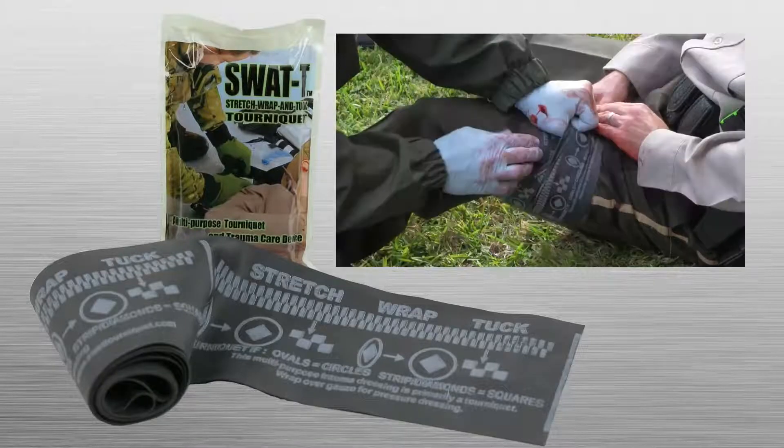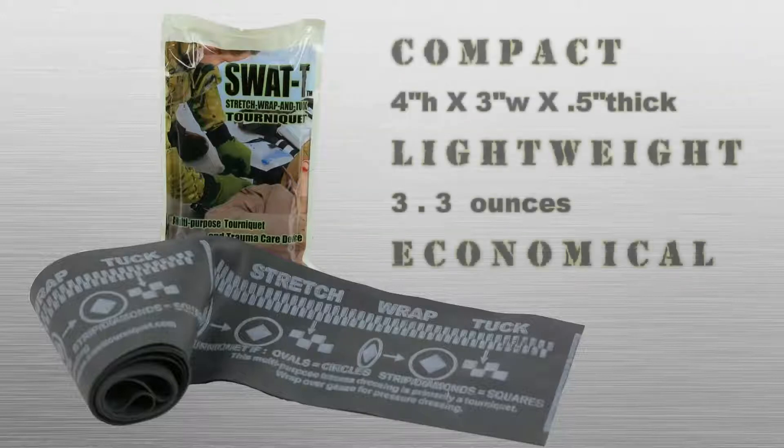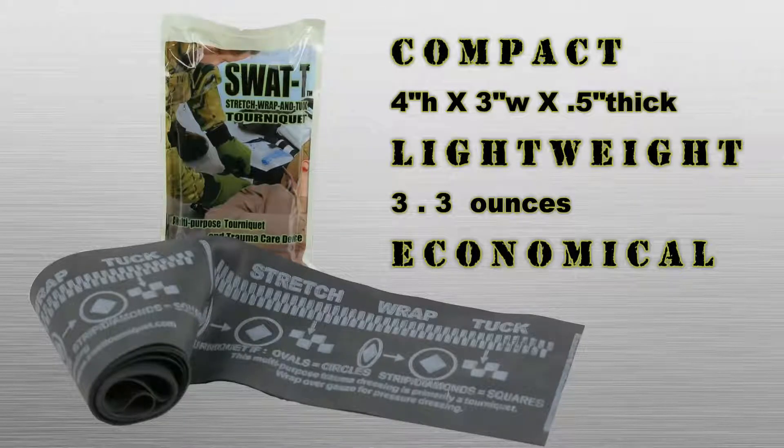The intuitive stretch wrap and tuck method is easily learned and retained by non-medical personnel and medical providers alike. The SWAT-T is compact, lightweight, and economical at less than half the cost of other tourniquets on the market.